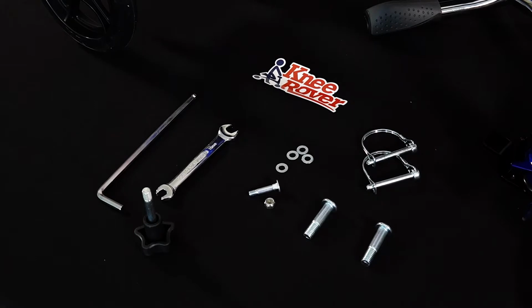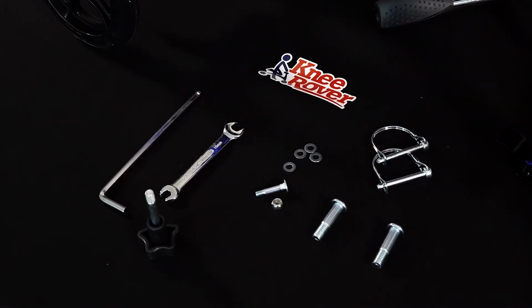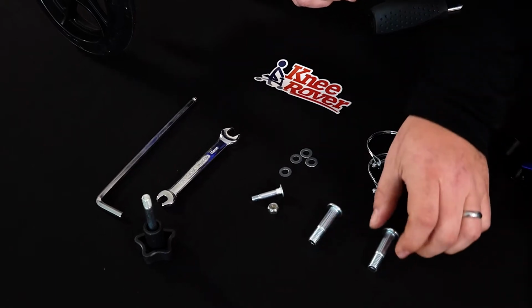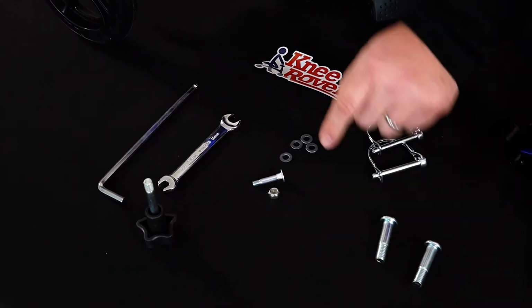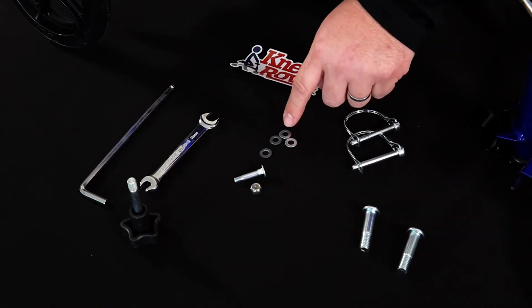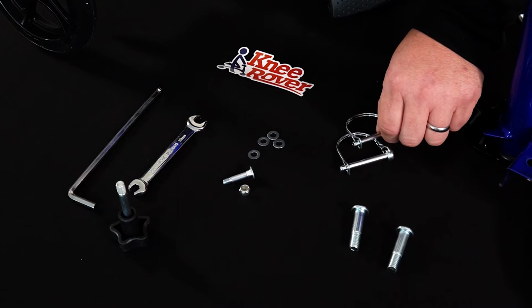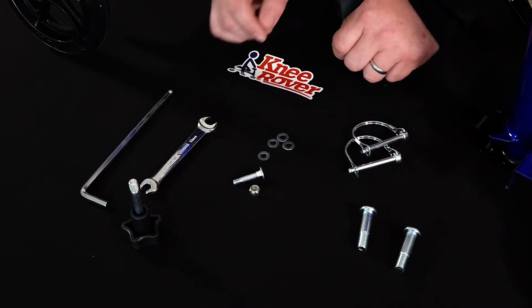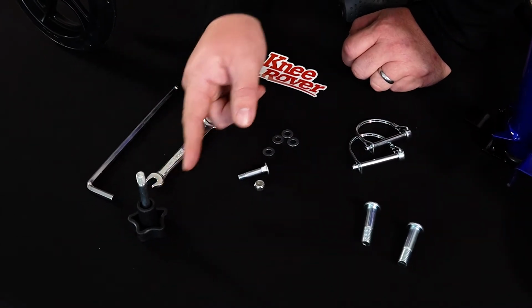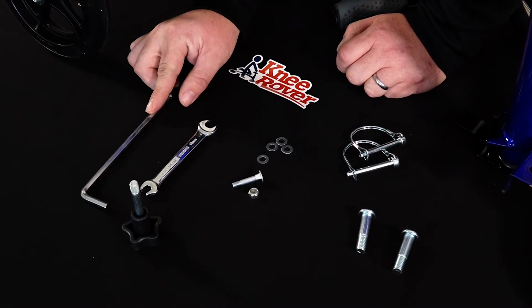All right, before we get going, I'm going to go through everything that you're going to need to assemble this scooter. So we have our front axle bolts. Then we have our tie rod hardware, the bolt, the nut, and the 4 washers. We have 2 locking pins. One of these is going to be extra. You have your height adjustment knob. You have your 8mm and 10mm wrench, and then your Allen wrench.